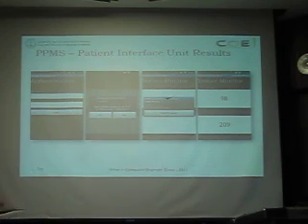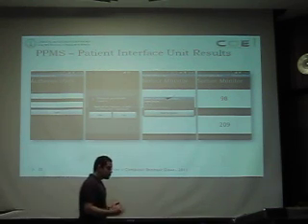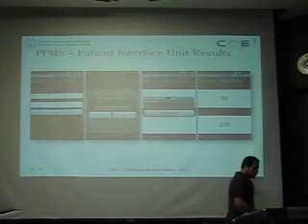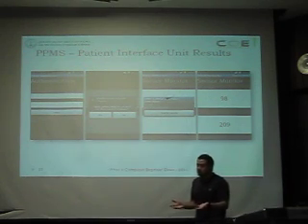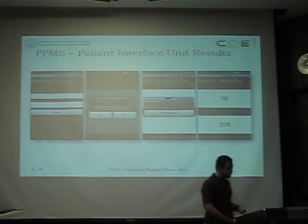So you have to authenticate yourself first and then connect through Bluetooth to the patient interface unit, and then you can see the sensor readings, and of course after that you can send any notes, pharmaceutical notes, observation notes, or anything.